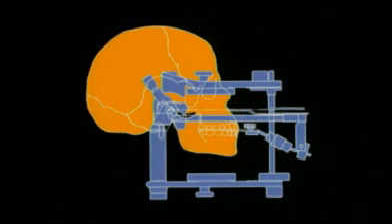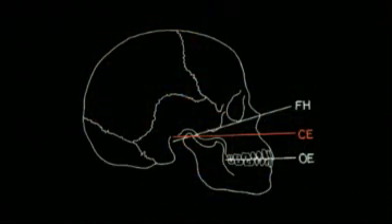The UTS permits the transfer of the spatial position of the patient's Bonwell triangle to the joint components of the articulator. The UTS is suitable for model orientation according to Camper's plane, the Frankfurt horizontal, and the sagittal median plane.